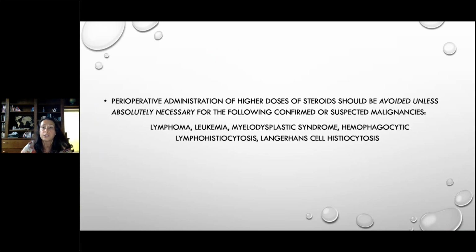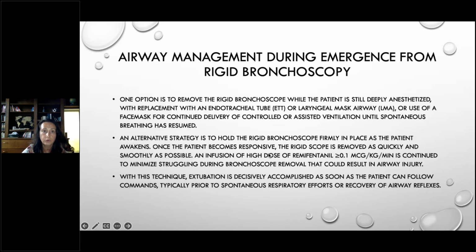Administration of high doses of steroids should be avoided in patients with these malignancies because of the risk of tumor lysis syndrome. So how do we manage the airway during emergence from rigid bronchoscopy? In most of the institutions that I have worked in, we just exchange the rigid bronchoscope with a laryngeal mask and then reverse the patient and let them wake up.